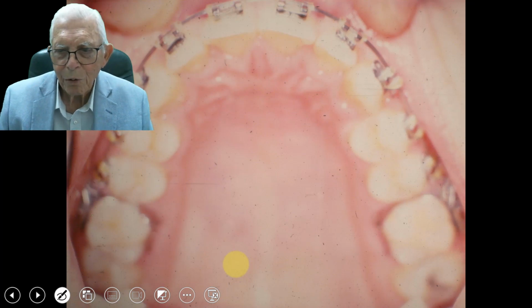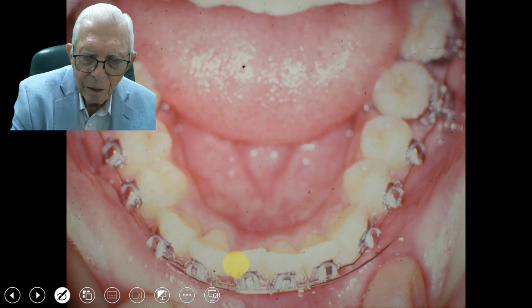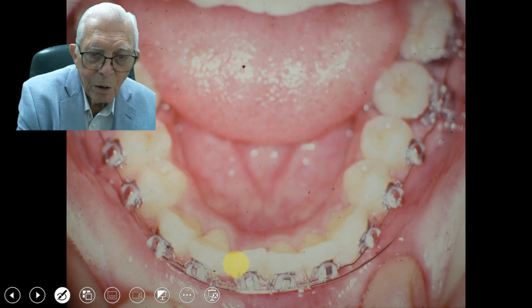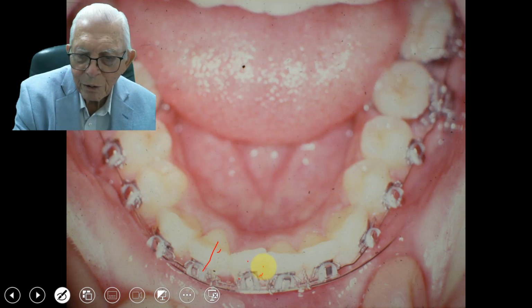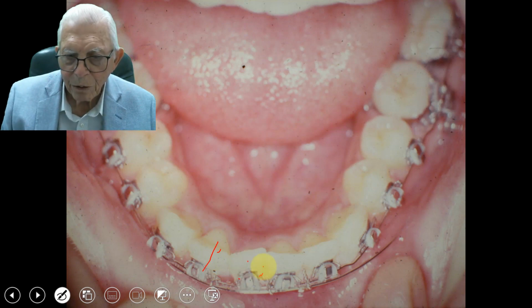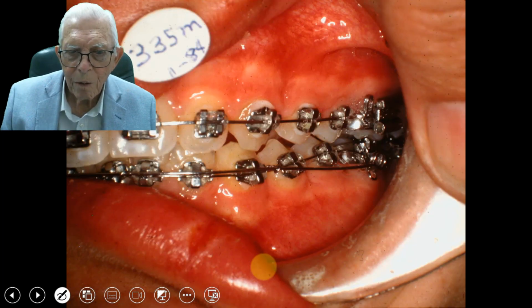And these all three were bad, but I have to show them. Now, we've got this around and enlarged, and we'll bring this tooth into this spot. We've got to still get a little more expansion in the arch, and we'll pull that one in too. So we go here in 1984.